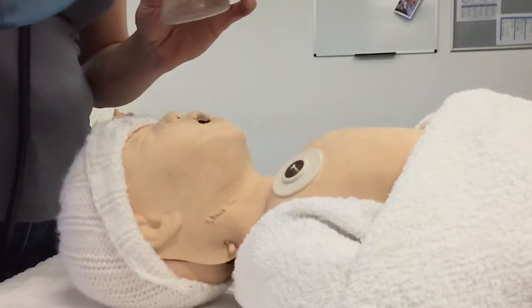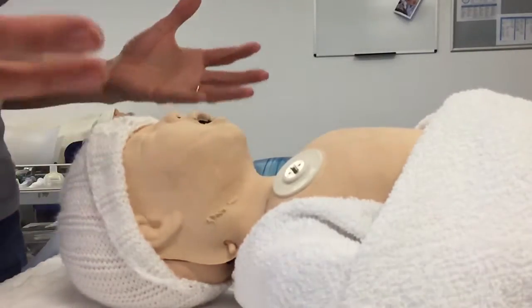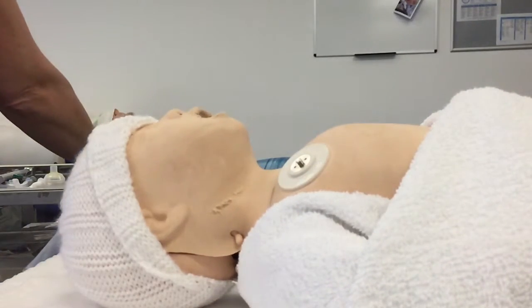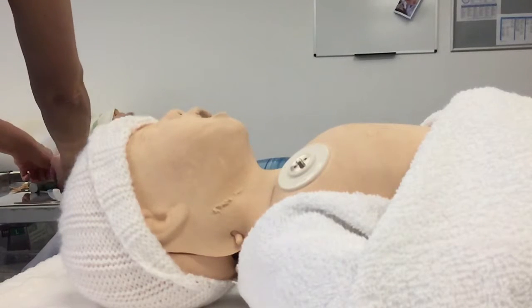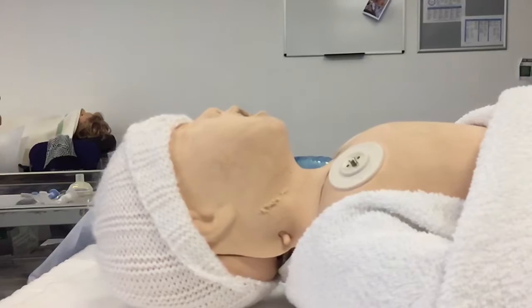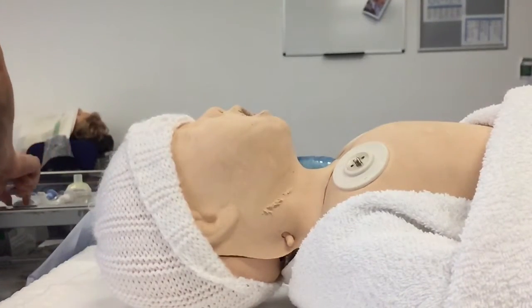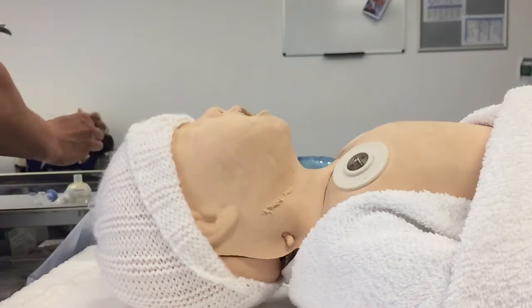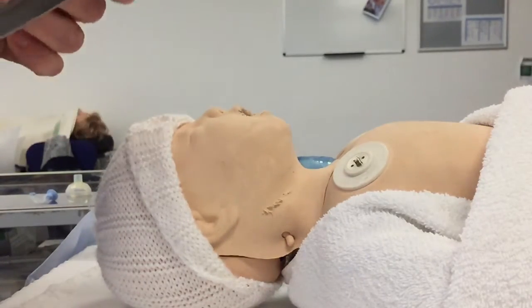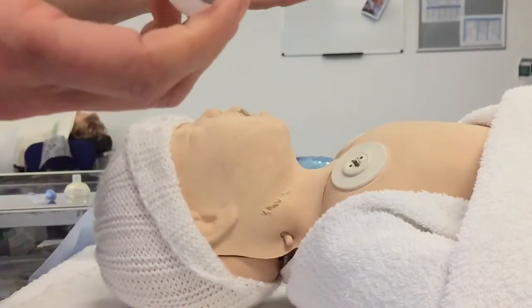I now need to consider that there might be some form of airway obstruction, or the tone is so poor that I need to do something to keep this baby's airway patent. So I'm going to inspect the airway. If I have help in the room, I'll ask them to put a SATS probe onto the baby's right wrist to get pre-ductal saturations. I'll gather my equipment: a paediatric Yankauer sucker, a laryngoscope, and some airway adjuncts or Guedel airways.